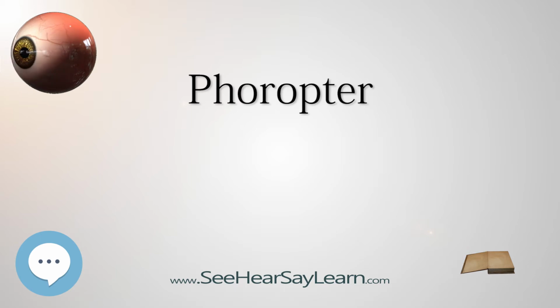Sometimes the habitual glasses Rx or an automated refractor is used to provide initial settings for the phoropter, and sometimes a retinoscope is used through the phoropter to measure the vision without the patient having to speak, which is useful for babies and people who don't speak the language of the practitioner.